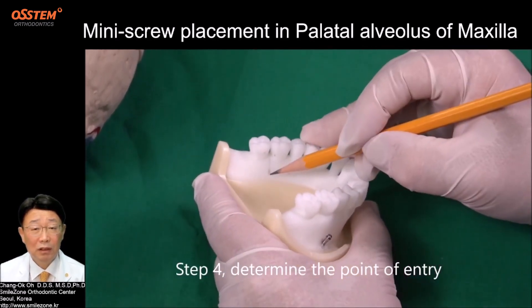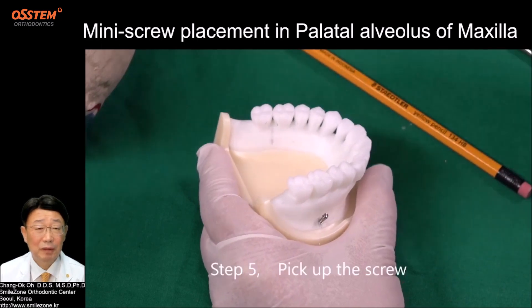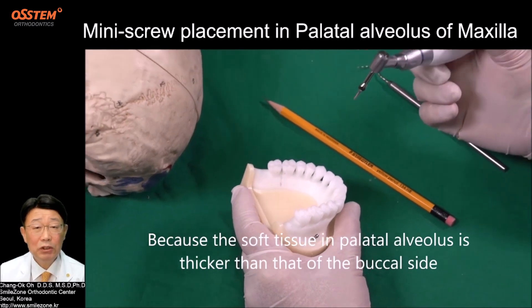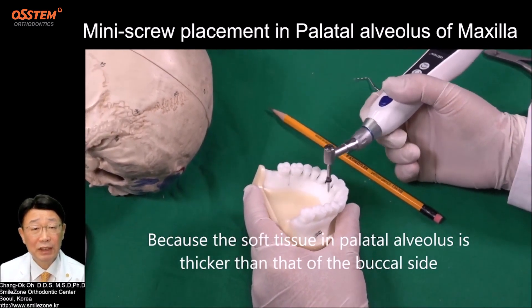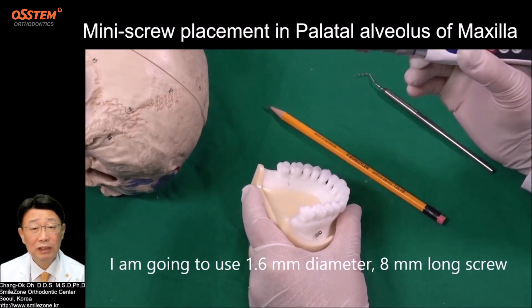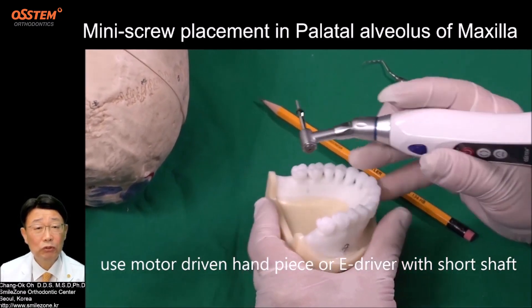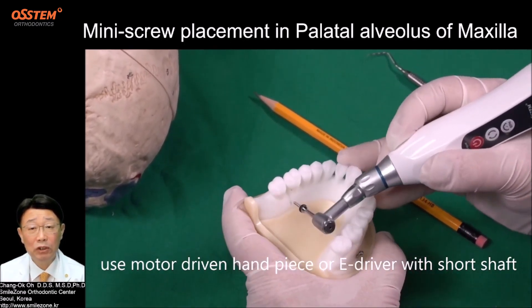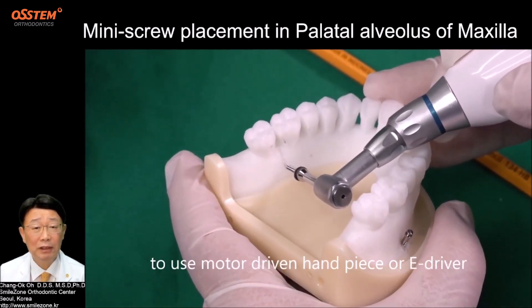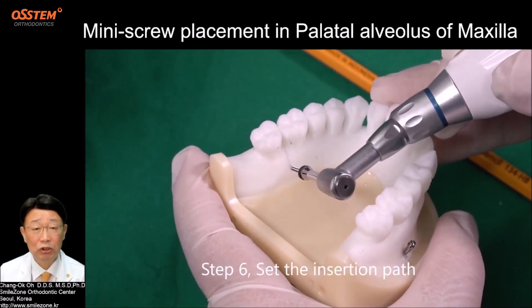Step 4: Determine the point of entry. Step 5: Pick up the screw. Because the soft tissue in the palatal alveolus is thicker than that of the buccal side, use a 1.6 mm diameter, 8 mm long screw. Use a motor-driven handpiece or e-driver with a short shaft. In every palatal insertion, it is strongly recommended to use a motor-driven handpiece or e-driver with different lengths of shaft.